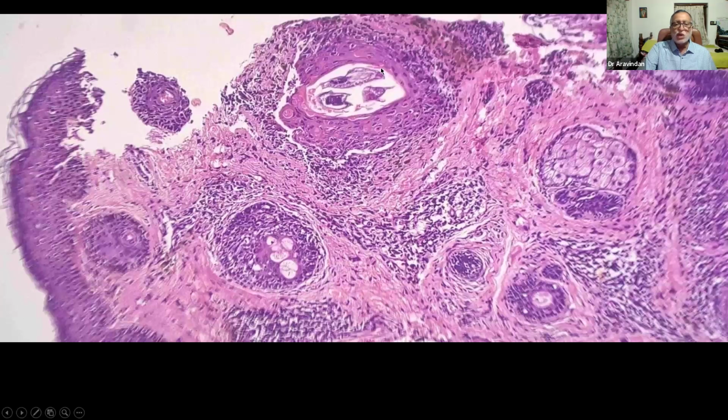In this case, again, you find a parasite here. You can see the demodex. Multiple demodex are seen in the follicles, and the follicles are also inflamed. So in such cases, maybe it is the demodex that is producing an inflammatory reaction, and you may be justified in such cases in calling it demodex folliculitis, though demodex will not always produce inflammation. It may be just a commensal organism, seen in many biopsies lying cleanly within many follicles. But in this case, at least, there seems to be a folliculitis and numerous demodex all around.